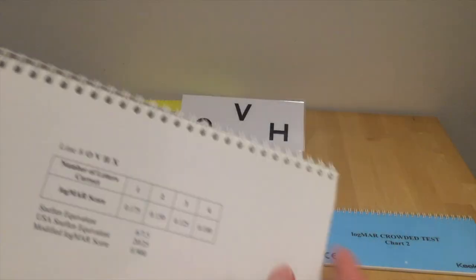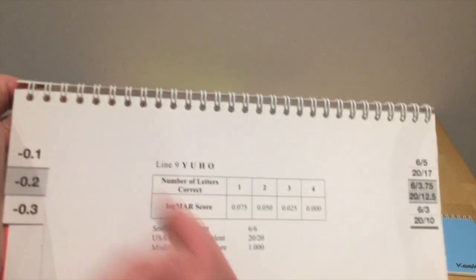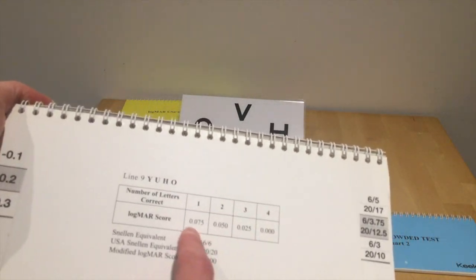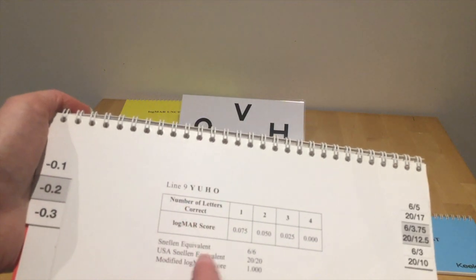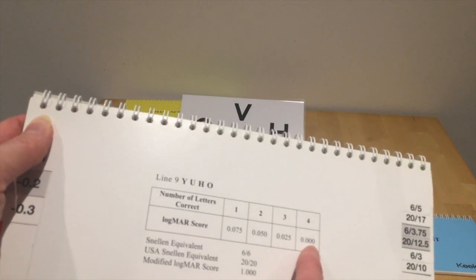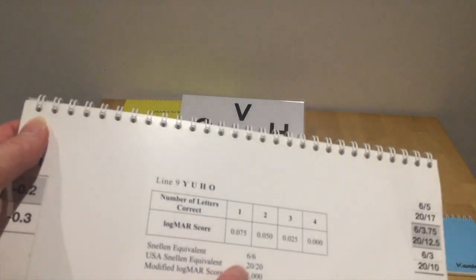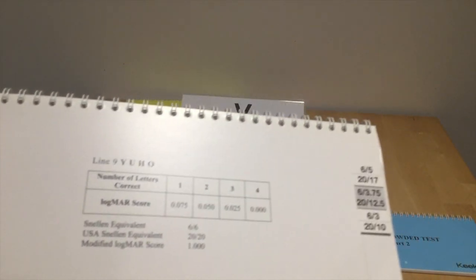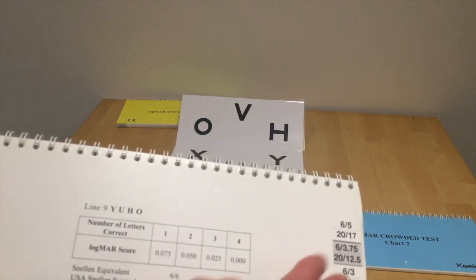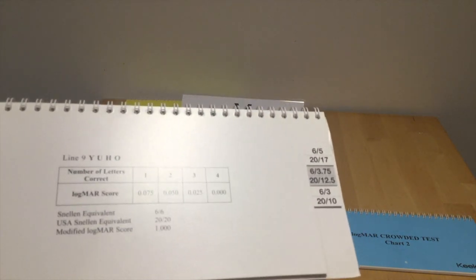Just move down to 6/6, line 8, and line 9 is 6/6. I'm going to tell you Y U H O, and if we get them all correct, it's 0, because remember this is the 6/6 line, and that would be our equivalent in logMAR. This test goes on and actually tests smaller sizes than that. Again, if you're getting into those sorts of levels, it's likely that you're going to be seen by the TVI.